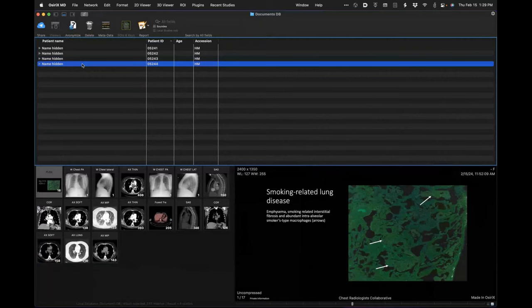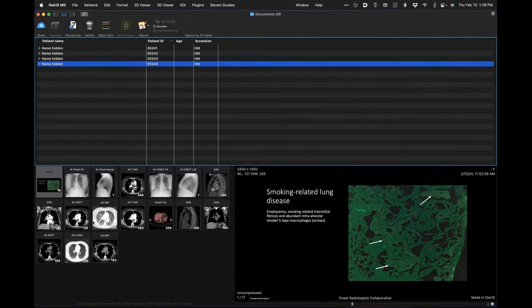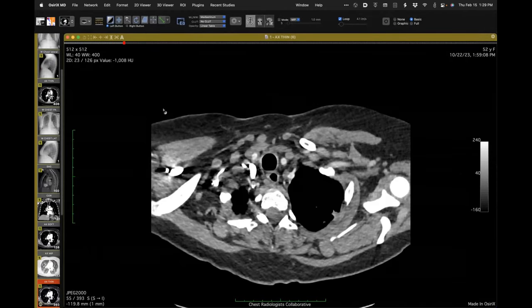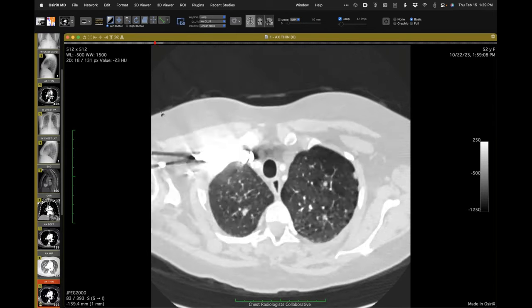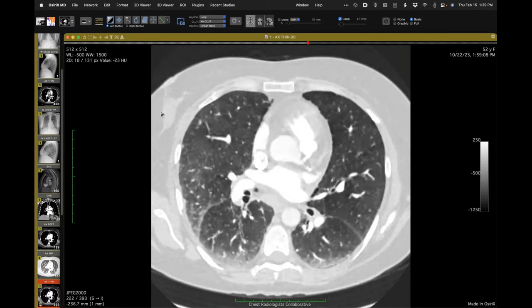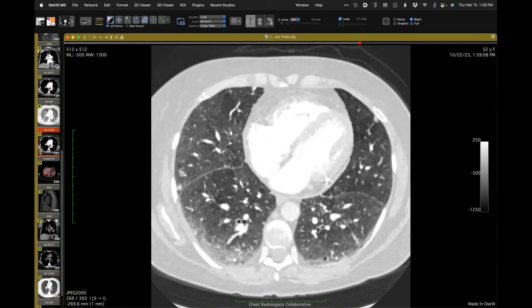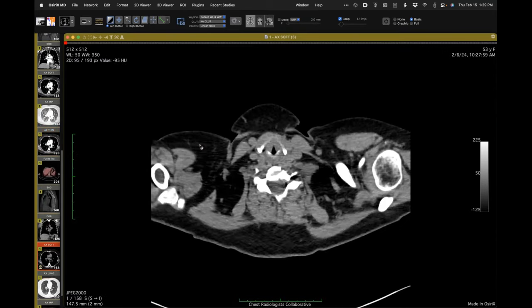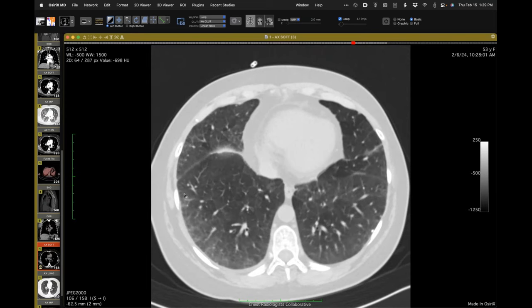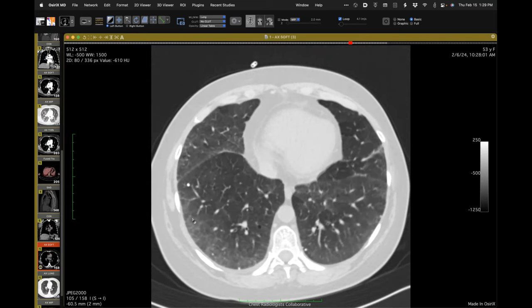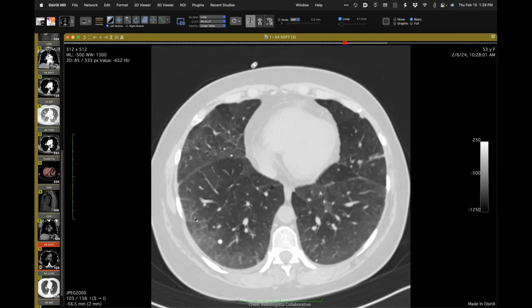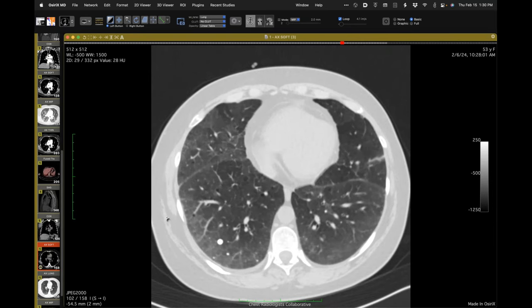Last case from pathology. A pathology colleague had a surgical lung biopsy for supposedly nodular disease in a smoker. Scrolling through the CT — down here we have a lot of hyperattenuation abnormality in these lungs, very opaque. Used to call this desquamative interstitial pneumonitis, now favoring the term massive accumulation of smoker's macrophages in the lungs. There are granulomas all over the place and a little cystic space.